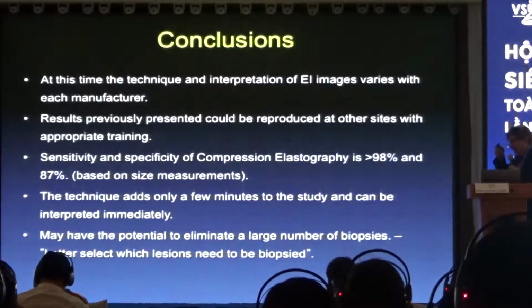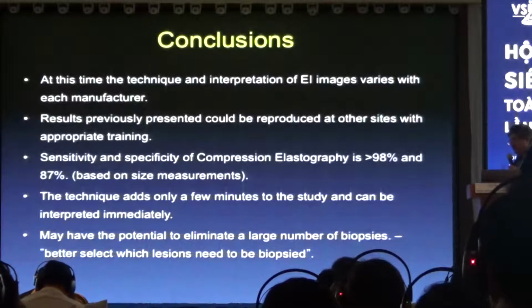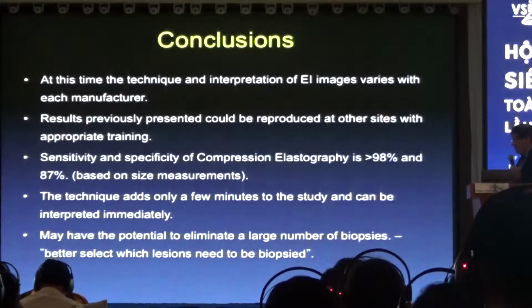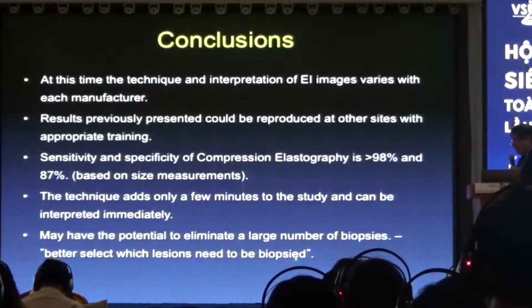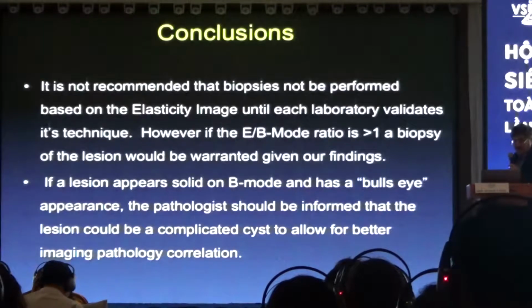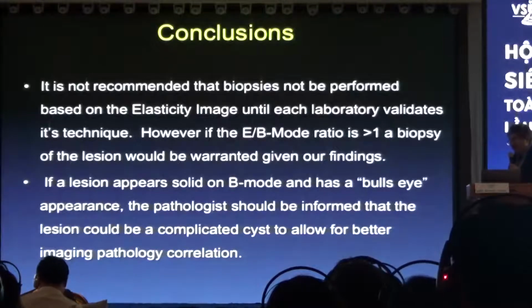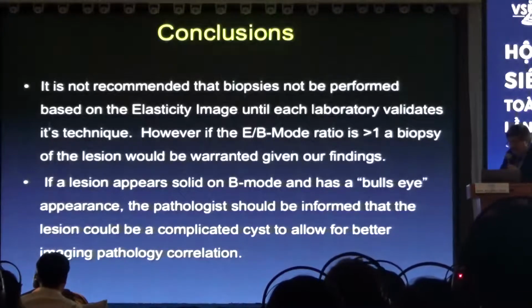And we make a very big impact on women. And we do this real time so that we tell the patient the results when she's there. And it's very helpful for them. And they're all very happy if we can cancel a biopsy because she doesn't need it. Really only adds a few minutes once you're trained. And again, I like to say it better selects which lesions need to be biopsied. We've eliminated a large number of biopsies. And again, I would like to remind you that you have to feel comfortable with the technique and confirm that you're doing good before you start canceling biopsies.